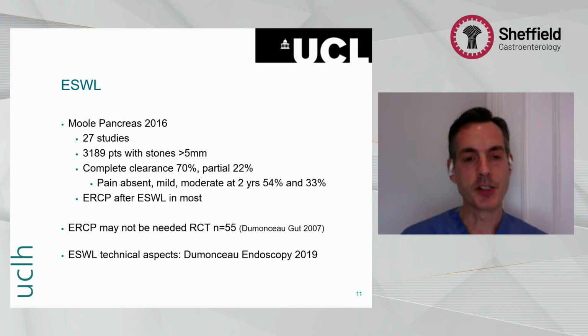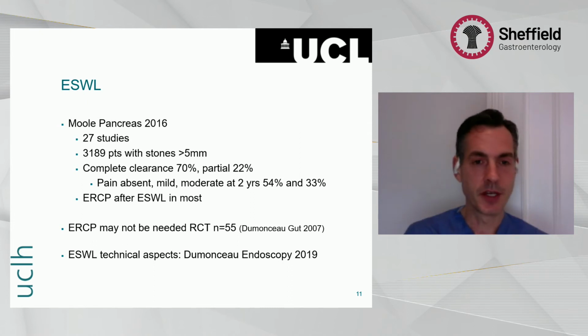And most of these trials used an ERCP following ESWL, although in a reasonable RCT, albeit from 2007, it was shown that if the stone is small, you probably don't even need to follow it with an ERCP, which I've always found slightly mystifying, but that's the data. And if you want some technical aspects of ESWL, which is an interesting read, again, the ESG guidelines are useful.